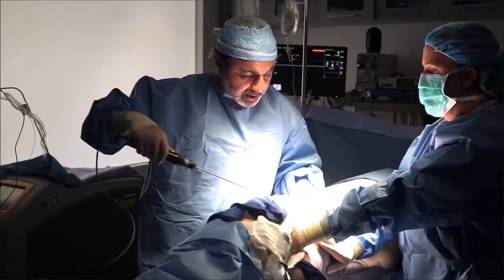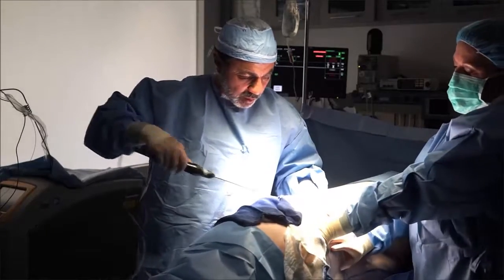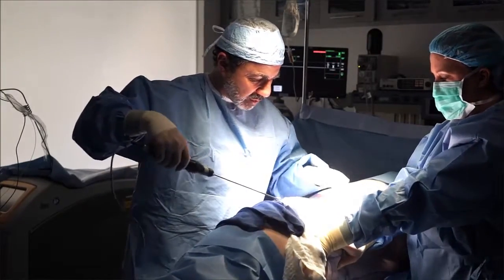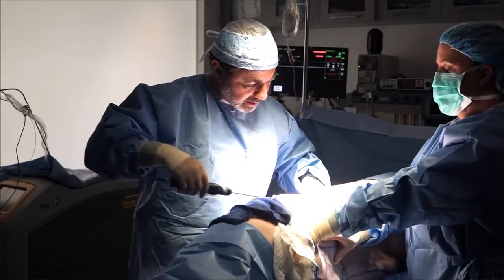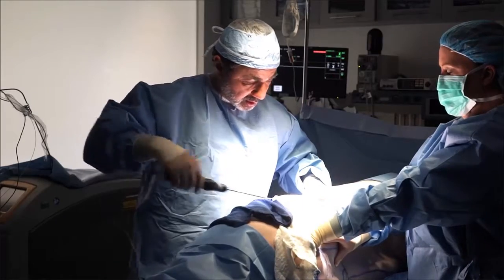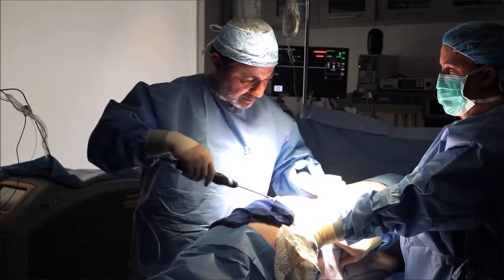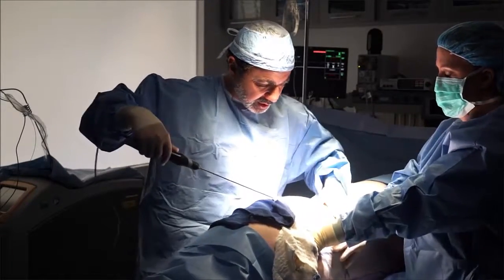As I've said many times, to me, the orientation of the tissue is very important. And this is really the main reason why I want a patient conscious, because Morgan is tightening her body up and being in the right orientation, so I'm following that layer of fat. It not only helps with reducing trauma to unnecessary tissues like the muscle and causes less bleeding, but it really is very important with results, so that I'm very precisely able to contour and sculpt the areas. This is the main reason why I don't like general anesthesia.